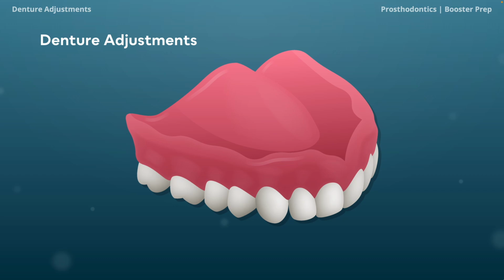completed a month ago, comes in complaining that the denture you made is rocking and not fitting well. Which, to be honest, is normal after full mouth extractions, since there's going to be a lot of remodeling happening of the residual ridge and tissues.